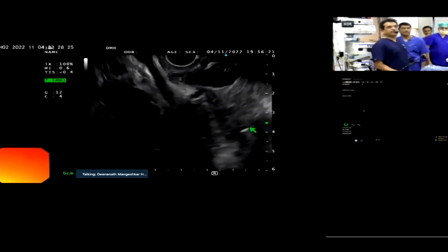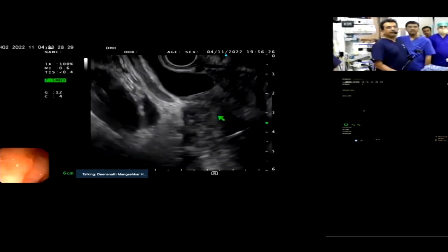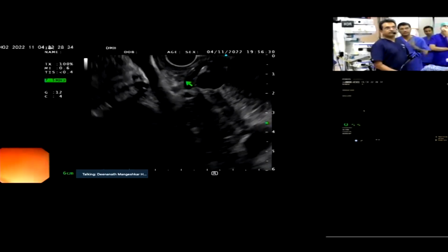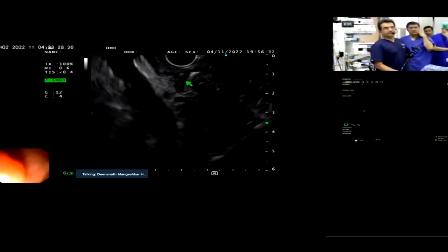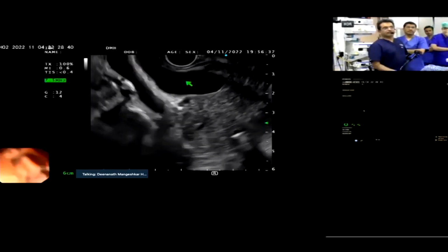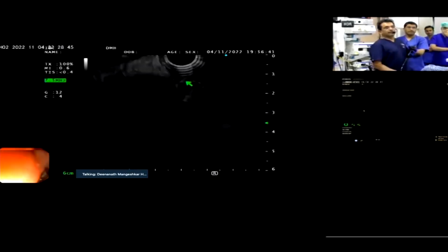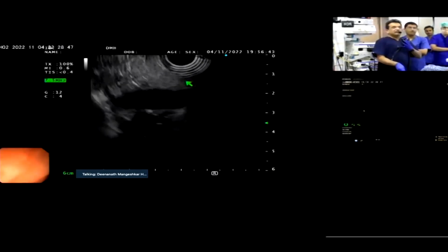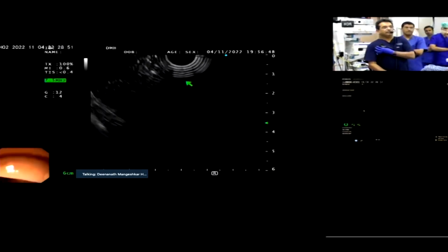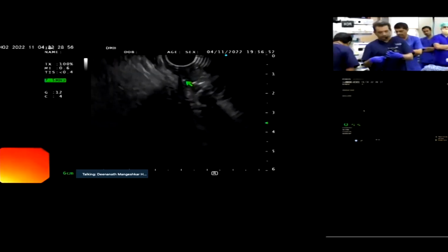Yeah, so that is probably the bile duct, which you can see, the dilated common bile duct, which is going downwards. And toward the right is the descending duodenum with the papilla, and toward the left is the liver hilum. And you can see the portal vein behind the bile duct. So now I will pass the scope into D2, into the descending duodenum, and we can have some water over here so that we can irrigate better. Can I have some water?